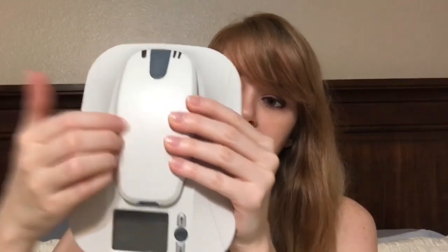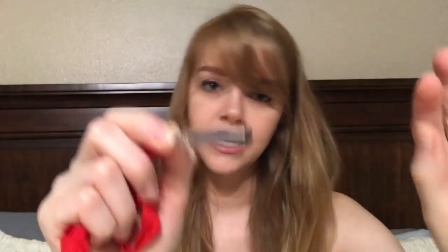So you've got your Linq monitor and your little patient activator that you keep on you all the time — I used to keep mine in my scrub pocket so anytime I'd have an event I could just pull it out, hit the button, and put it back. Here's the other part: this is the base station. It sits on your end table and every night it sends the signal to your doctor's office with your data from that day, as long as you're within about six feet of it. It'll tell you in the morning that it was a successful transmission. If you actually pick up the activator and scan the monitor, it will send the full EKG to the doctor's office — this was very key in getting the data I needed to get diagnosed.